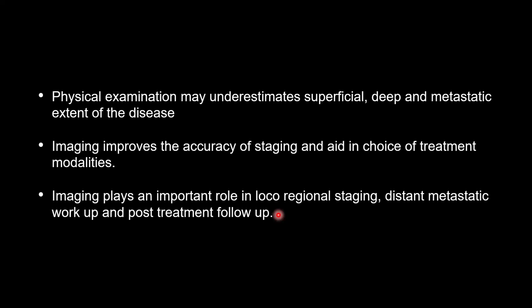So imaging improves the accuracy of staging and aids in choice of treatment modalities. It plays an important role in loco-regional staging, distant metastatic workup, as well as post-treatment follow-up.